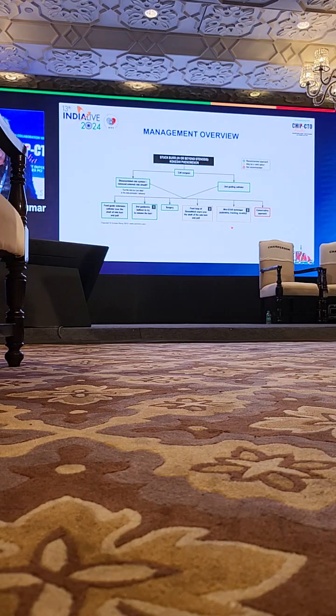Stuck rotablator, call the surgeon. Most important, do that first. And then there are green, I'll take exactly a minute. The green ones are the ones recommended on how to do it, and the red ones are the conservative approach, never do it. You cannot get away with the conservative approach.